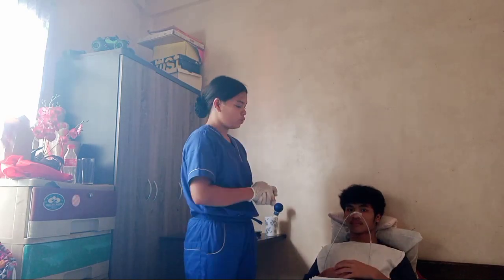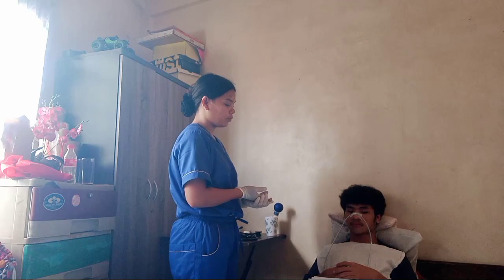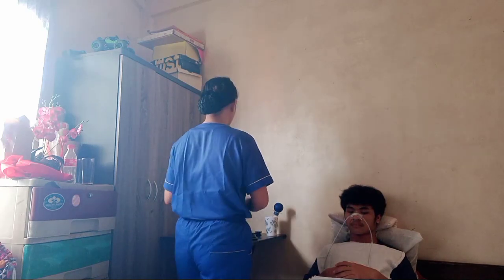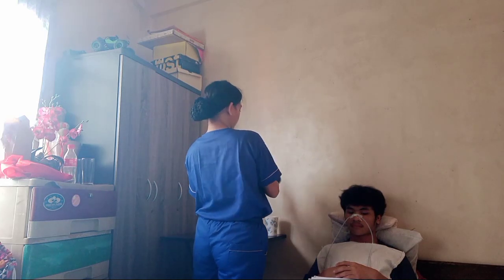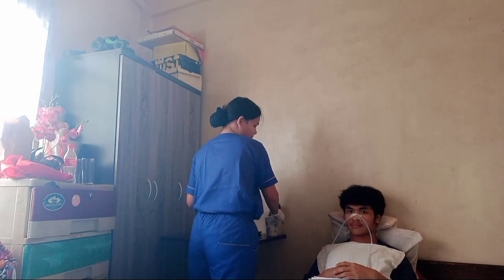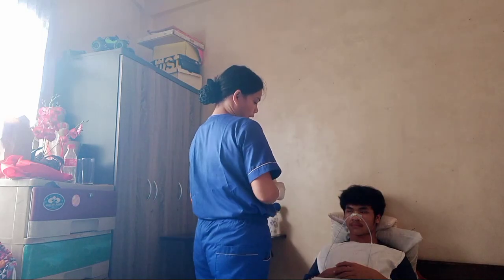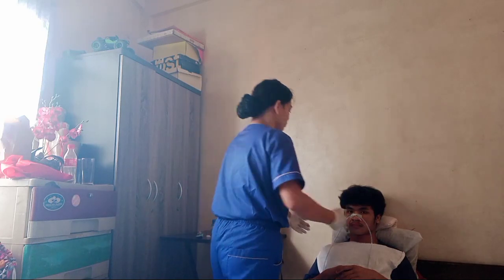So, now we will proceed to the gavage. So, prepare all equipment and prepare the formula. Check the expiration date and shake thoroughly. Then after that, always check the position of the client.